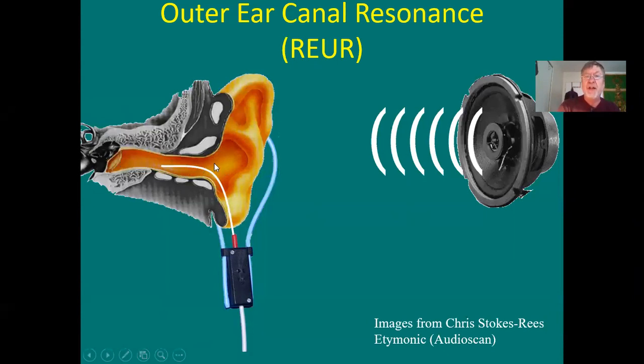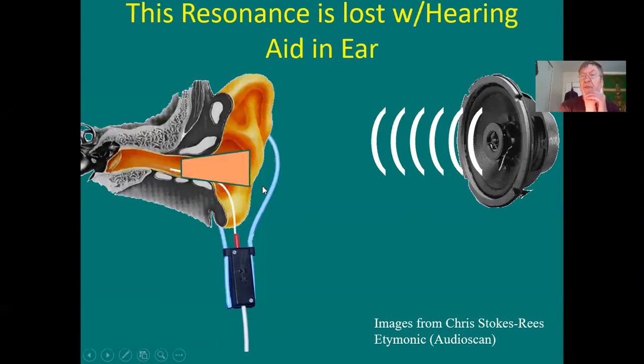Now, with real ear, they would then put the hearing aid inside the guy's ear, leaving the tube in place. Then they would have the sound coming from the speaker again, exactly the same sound, either a sweep tone or a composite noise.